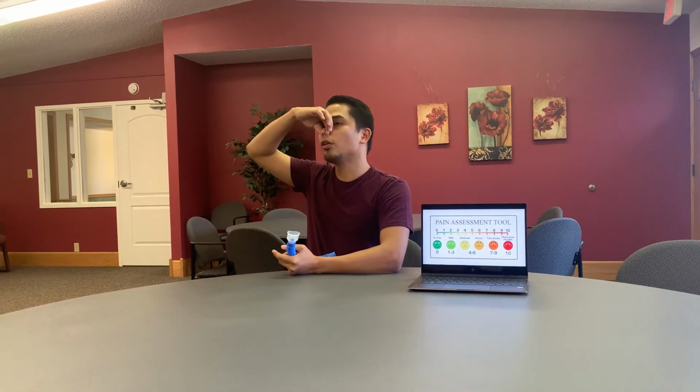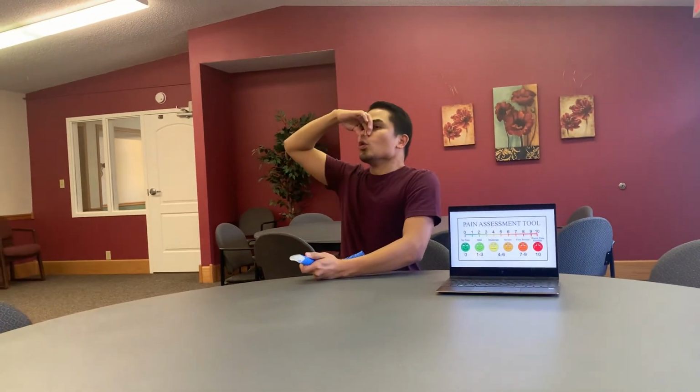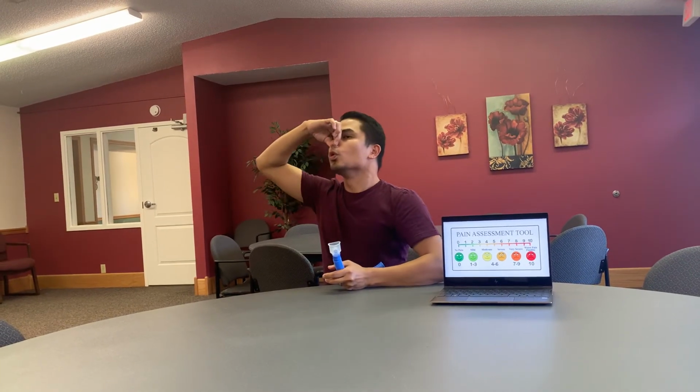So by doing a normal breath, take a deep breath in, blow. Then take a deep breath in again, like that.